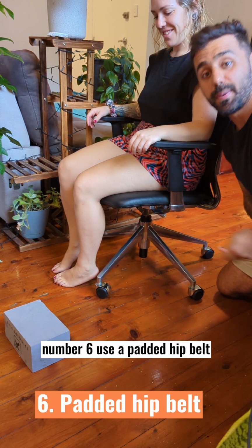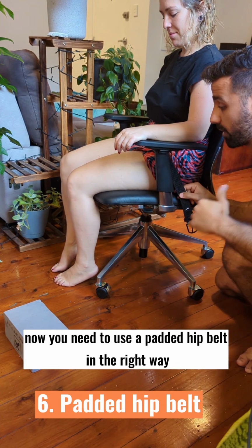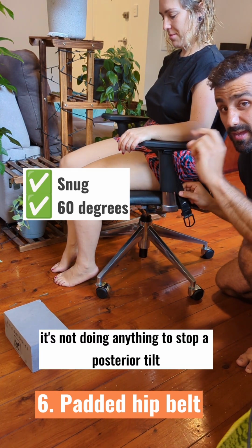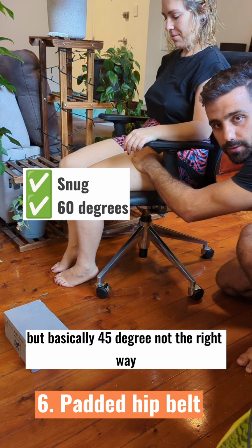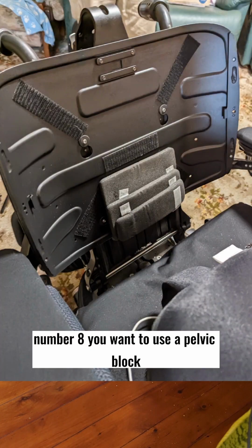Number 6, use a padded hip belt. This is not a padded hip belt. Now, you need to use a padded hip belt in the right way. One way is to make sure it's snug, so it actually holds the hips in, so if it's loose, it's not doing anything to stop a posterior tilt. And 2, make sure it's positioned in the right way. I'll do this in another video, but basically, 45 degree, not the right way. 60 degree, great way.